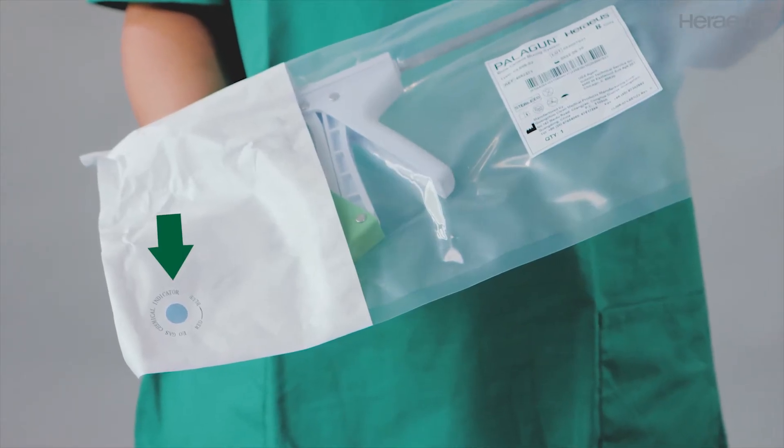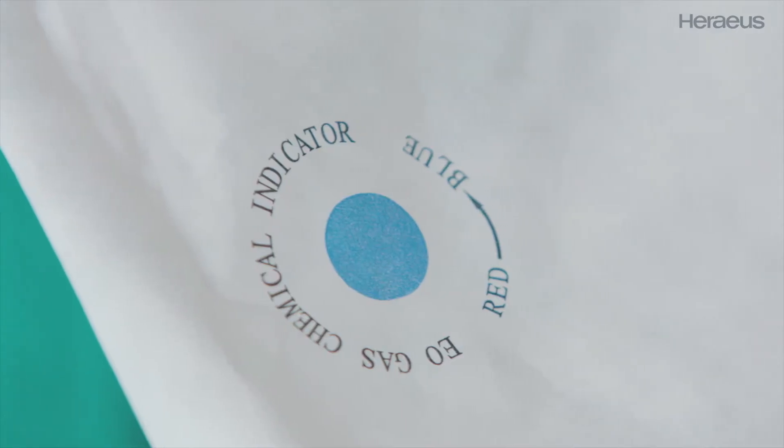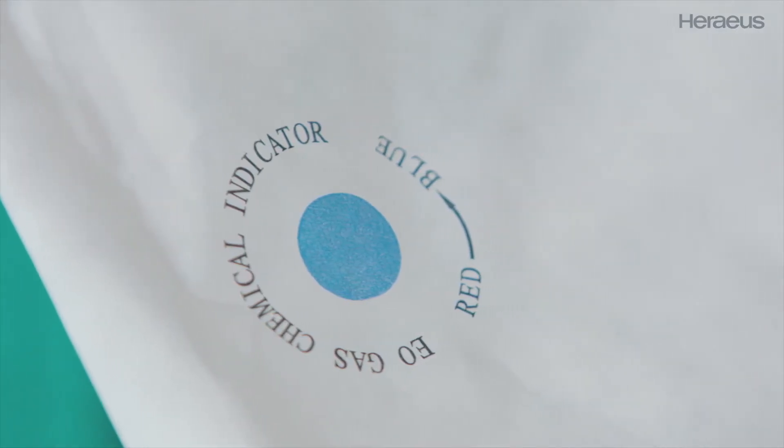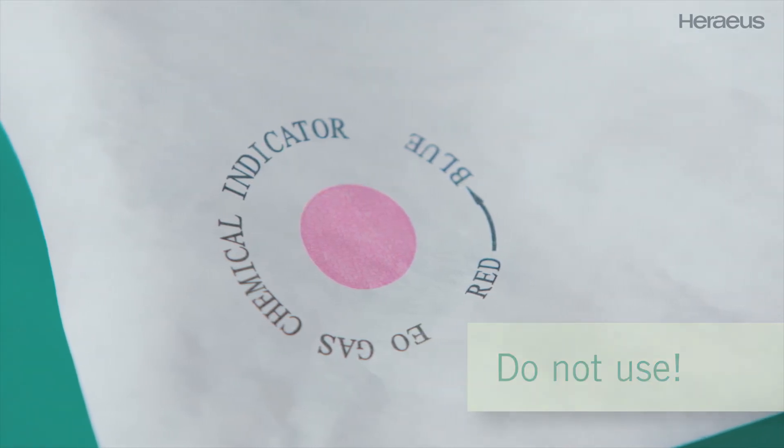The inner pouch has a sterile indicator located on the white Tyvek. When the indicator is colored blue, the contents are sterile. If the indicator is colored in red, this product is unsterile and must not be used at all.